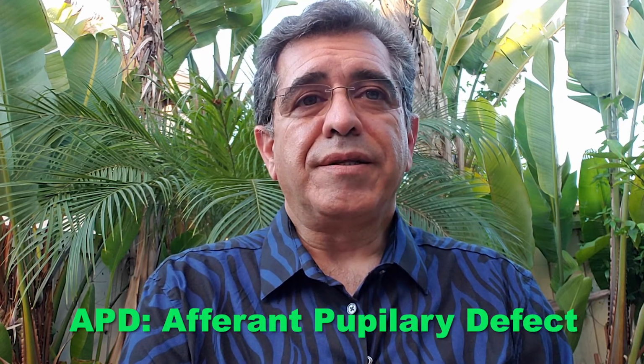Afferent pupillary defects are never considered normal. There must be a reason for the presence of a positive APD finding. So how can we be sure there's no positive APD in that half a minute or less that we are given to examine the pupil right before we instill the dilating drops? As you know, once tropicamide or phenylephrine drops start their action on the iris, it's too late for any pupil testing. We have to wait a few hours until both pupils return to their natural state.